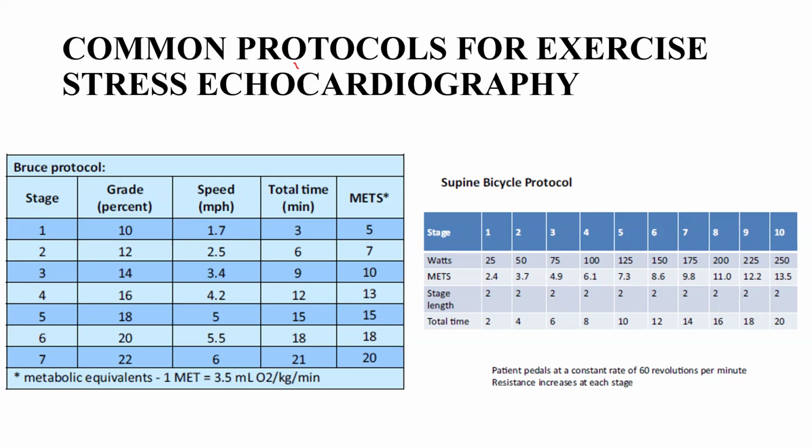You understand? You can determine it because the patient is in a position where you can do the echo whilst going along. Whereas for the treadmill stress test, apart from your baseline echo, the person goes onto the treadmill and you repeat the echo to assess regional wall motion or pressure gradients across the valves, diastolic function, and everything is done within 60 to 90 seconds when the person comes off the treadmill.